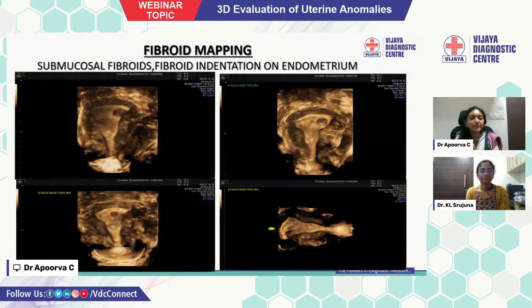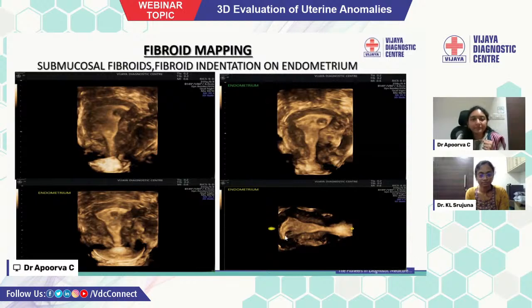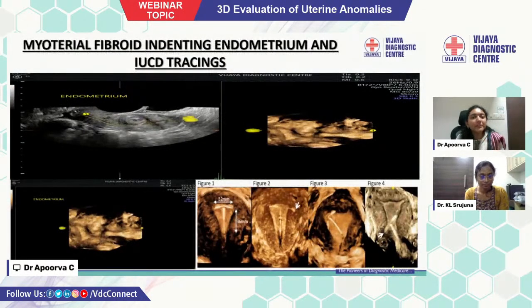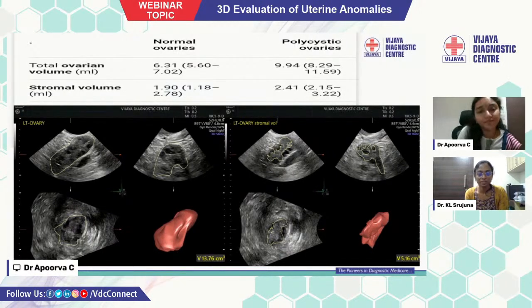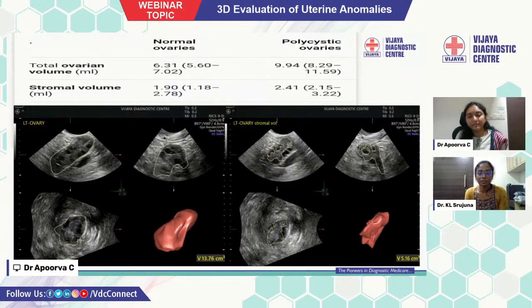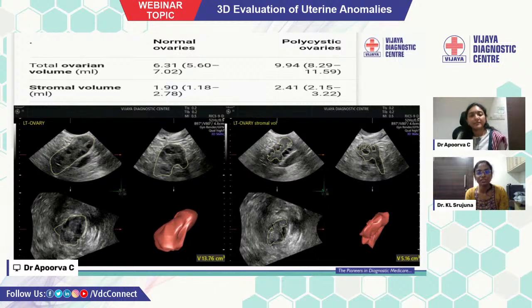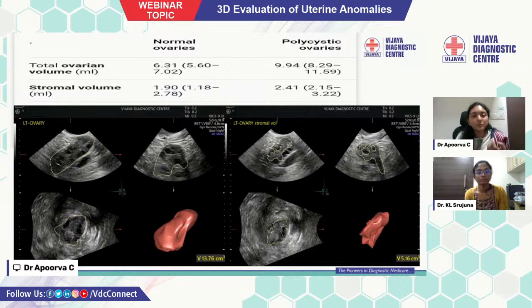3D ultrasound is very helpful in assessing the placement of IUCD, especially in patients presenting with abdominal cramps, to evaluate if the parts of the T-shaped IUCD are invading the myometrium — the exact location can be clearly seen. Additionally, three-dimensional stromal volumes can be calculated in cases of polycystic ovaries.